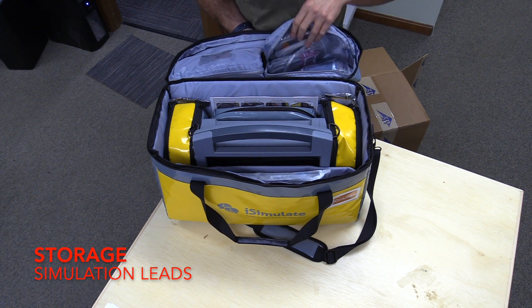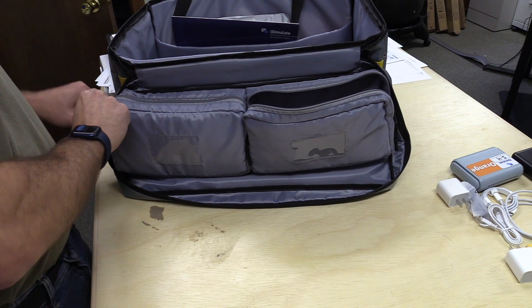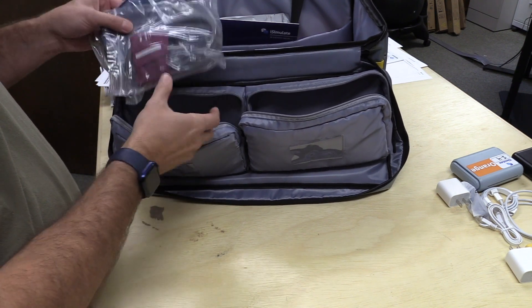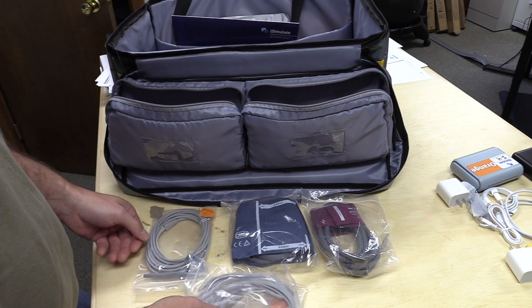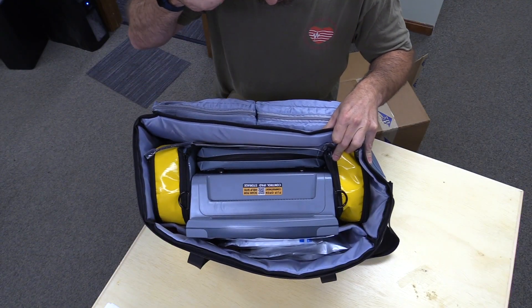In the other top storage pocket are simulation leads, which we'll use later in the process. These leads include your pediatric and adult blood pressure cuff, some ECG wires, SPO2, and temp sensor probe, all for use during simulation.